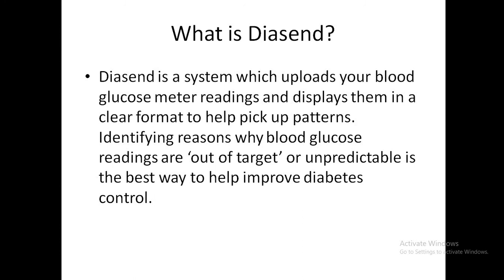Diasend is a very popular system in the UK. It uploads blood glucose meter readings and displays them in a clear format to help identify patterns. You can also see how much insulin is being delivered. It makes it easy to identify out-of-target or unpredictable levels, helping to improve diabetes control.